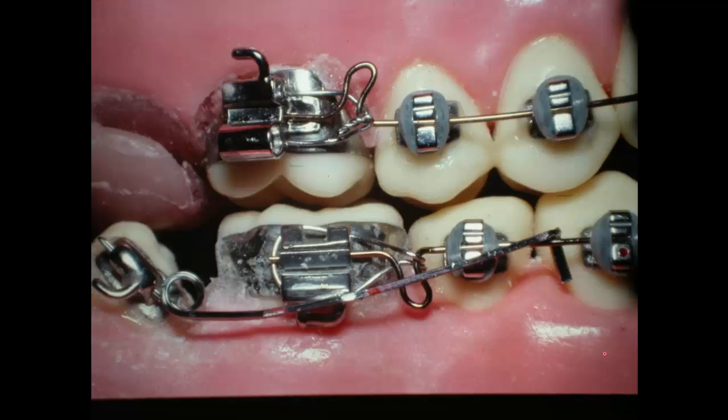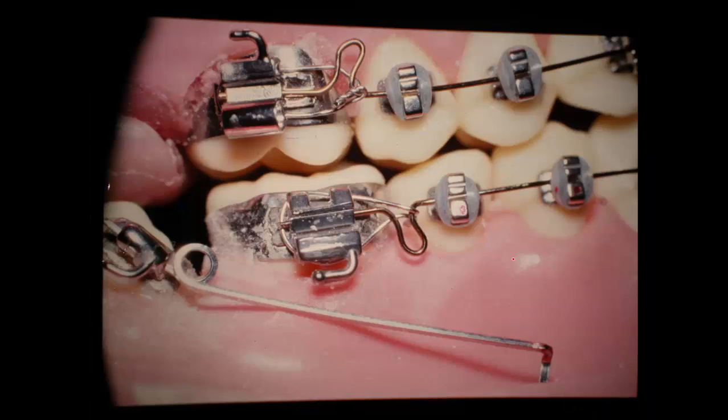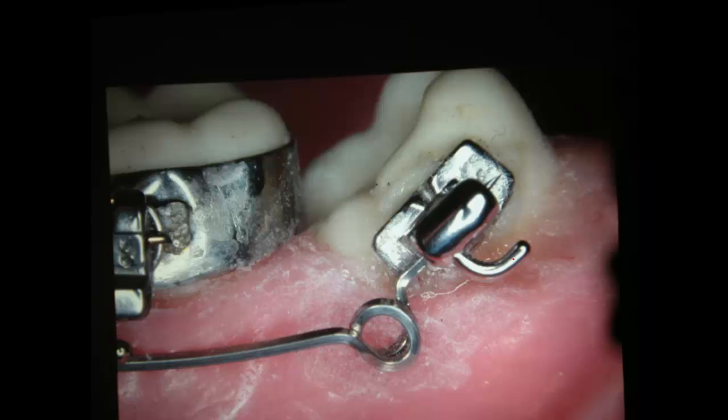Now, the hook would be placed, it's best if it's right close to this, because this tooth upright is going to go back and this hook will slide back till it gets to this tooth right here. Give it space enough, where the tooth can go ahead and upright and the spring will stay right in there like that. So that's just the spring again I want to show.